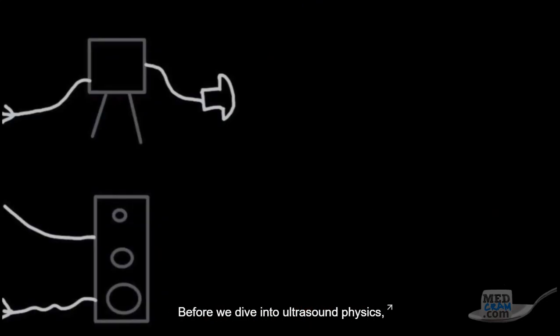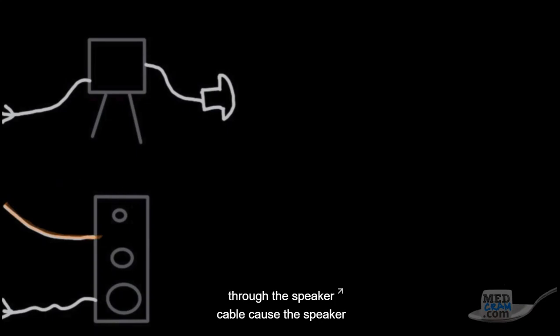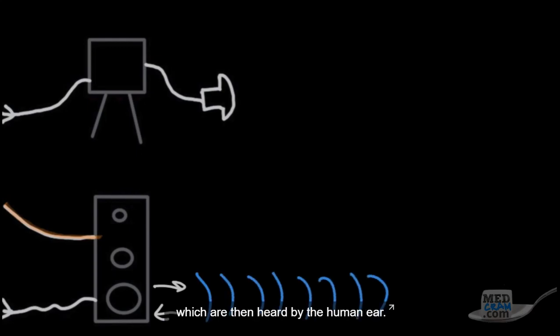Before we dive into ultrasound physics, I want to briefly explain how an ultrasound machine works. And while you may not be familiar with an ultrasound machine, you're likely familiar with the speaker. And since they both generate sound waves, it provides a good example. The speaker uses electrical energy, and the electrical waves that travel through the speaker cable cause the speaker to pump in and out. This generates sound waves in the air, which are then heard by the human ear.